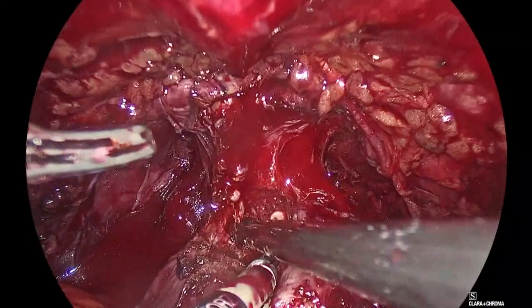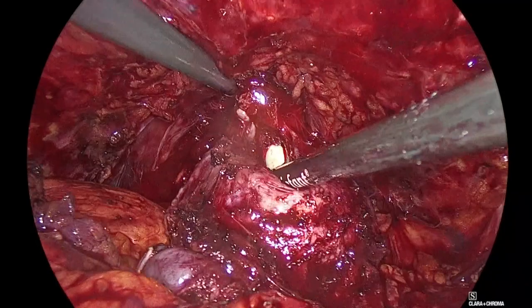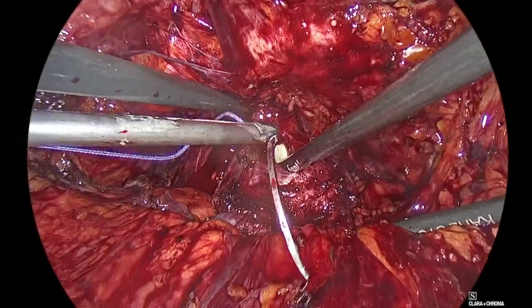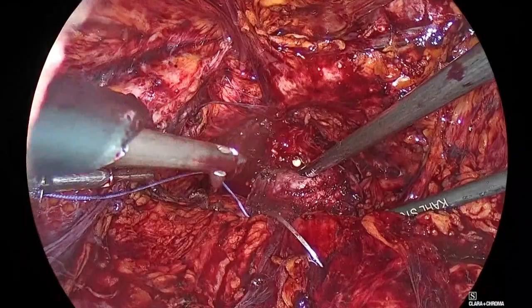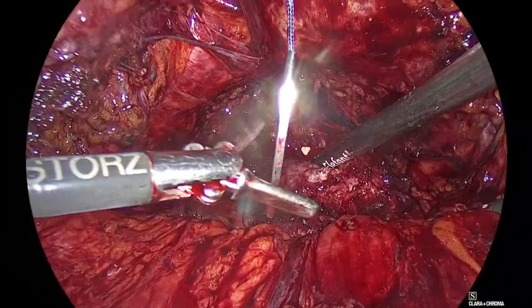Okay. Panagiotis, pull, please. Give me the suture, please. Go back, Badeli. Good. Give me the duck. Can the table go down, please? Table down, please. So this is a big needle, but Panagiotis, tension. We could go with a smaller needle also, but it's fine.